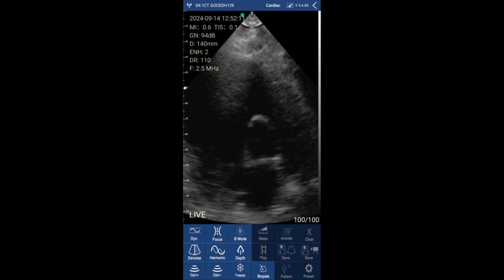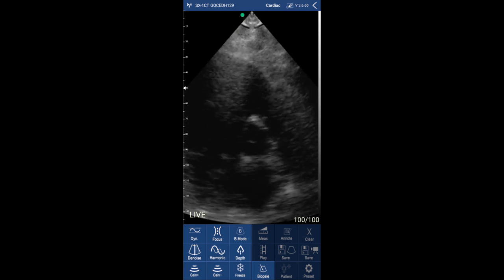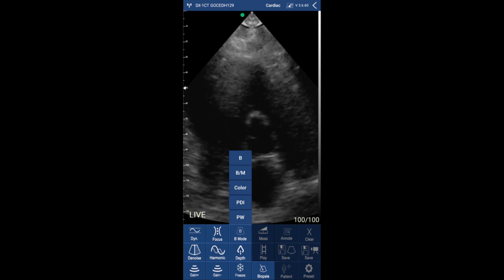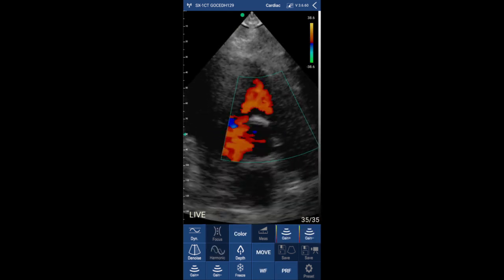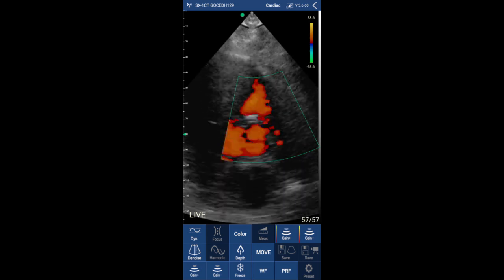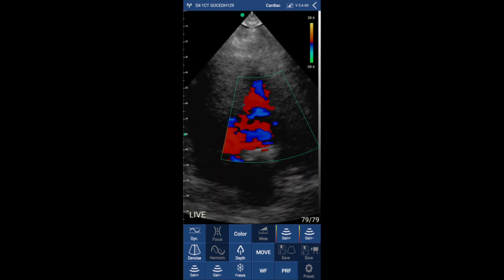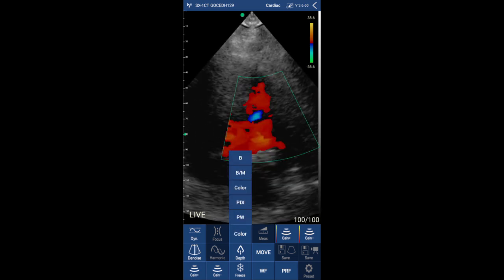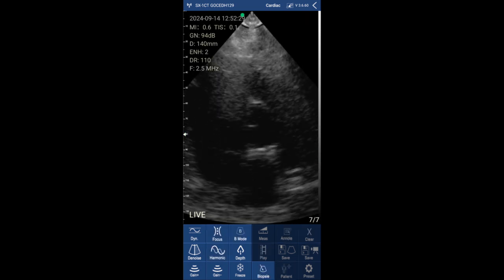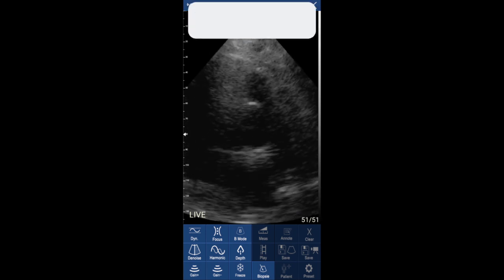Let's continue to the parasternal short axis view at the aortic valve level. I think the definition is very nice for a portable device — you can even see the aortic valve cusps. And again I'm using color Doppler on top of the pulmonary and aortic valve. It's very simple to use color Doppler and to switch back to 2D.